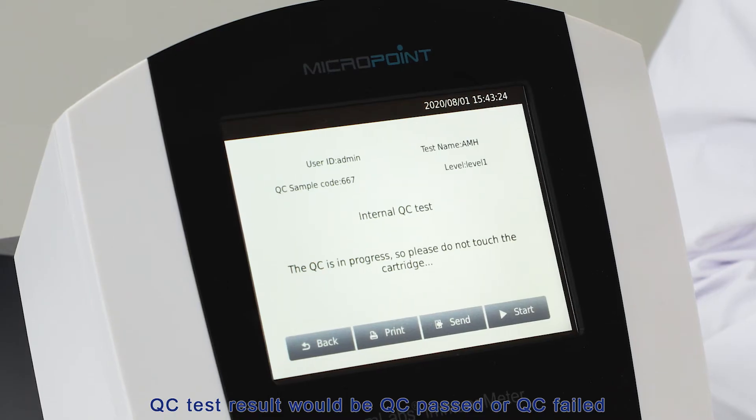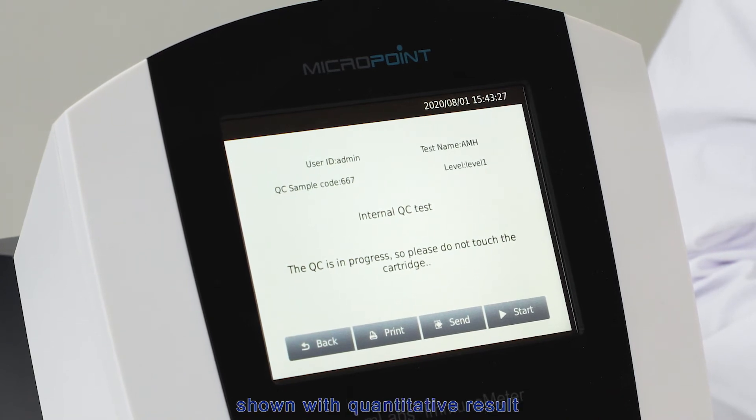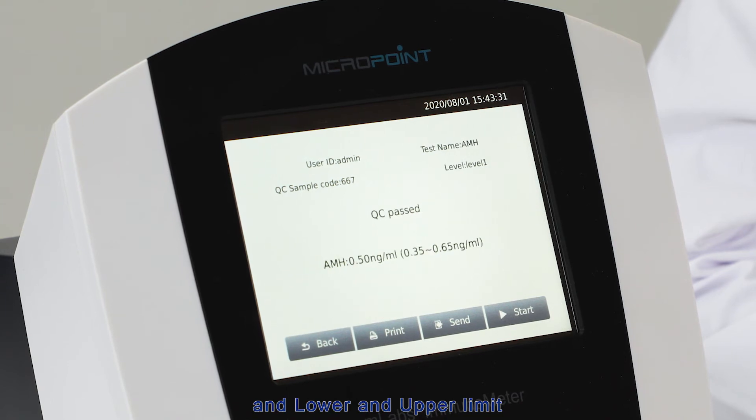The QC test result will show either QC passed or QC failed, shown with quantitative result and lower and upper limits. QC failed means the test result exceeded the limit range — you will need to repeat the QC process, paying attention to every detail of the operation. If it fails again, please contact your MicroPoint distributor for further information.